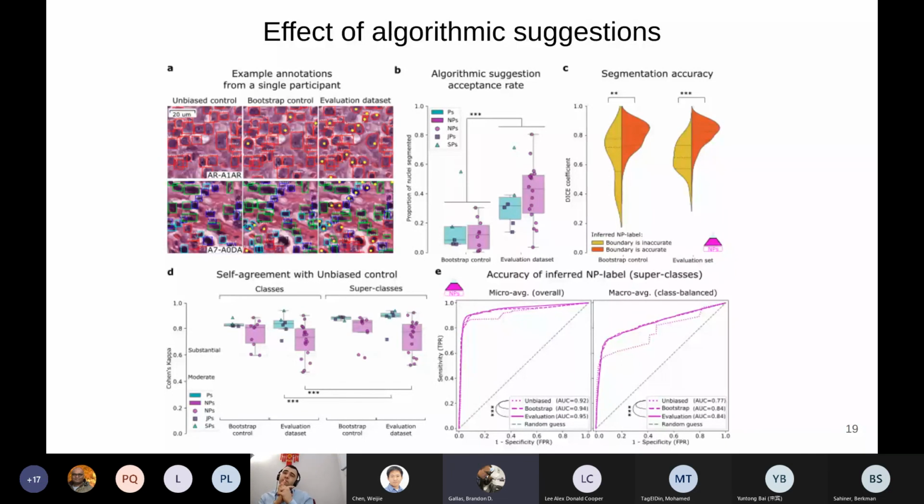Modeling, we can all work on algorithms at another time, but this is at the FDA, it's all about performance evaluation and about understanding that critical question of how many pathologists you need to get an accurate, valid truth.